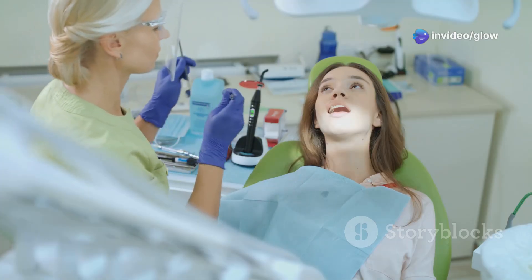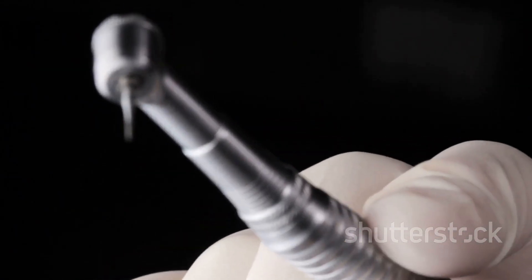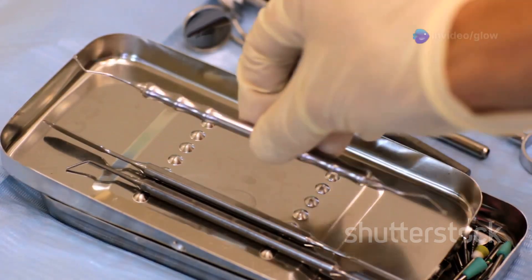Last but not least, your tools: hand instruments like excavators, rotary instruments like high-speed drills, and spoon excavators for that soft dentin. These are your best friends in cavity prep.